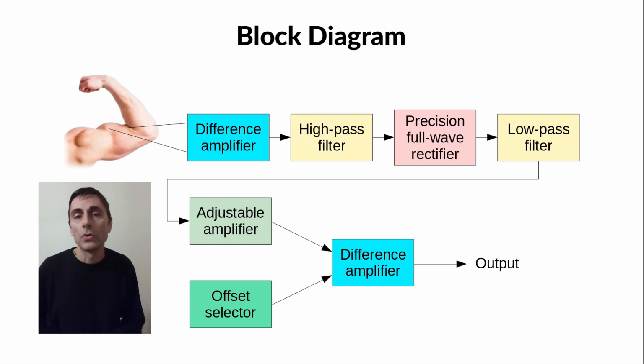The remaining signal goes through a full-wave rectifier and a low-pass filter in order to convert it into a DC signal. The signal is then amplified again in order to reach a voltage that is large enough to communicate with electronic devices. And optionally, an offset can be added to the signal in order to ensure its compatibility with the electronic device that you want to control.